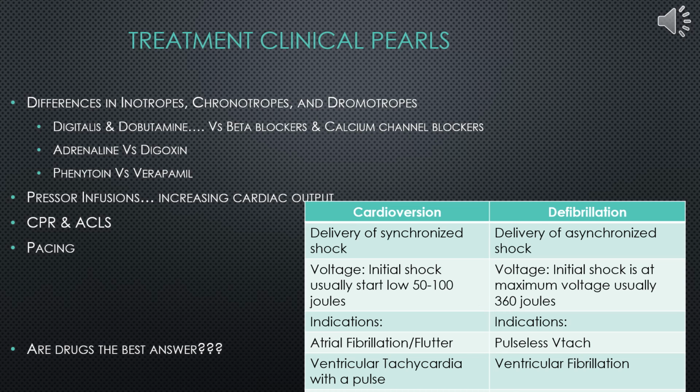When we're thinking about cardioversion versus defibrillation, I put this chart on here because sometimes I think people think it's the same thing, and it's not. These outline some of the most common differences between cardioversion and defibrillation.